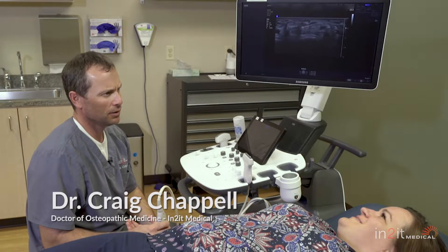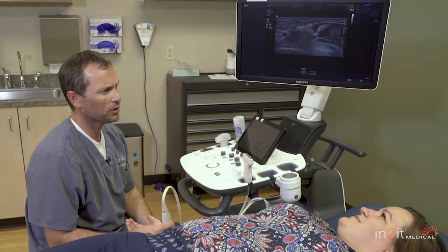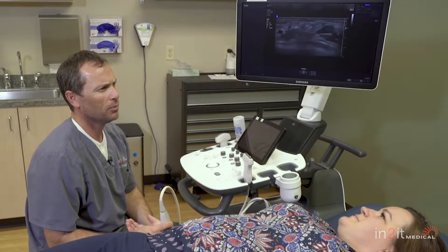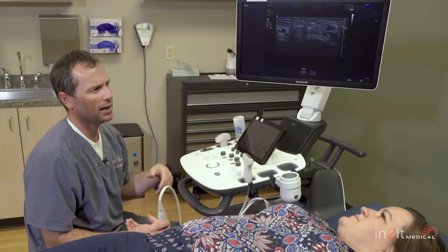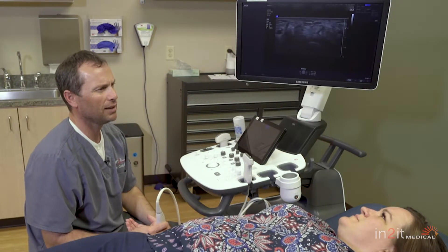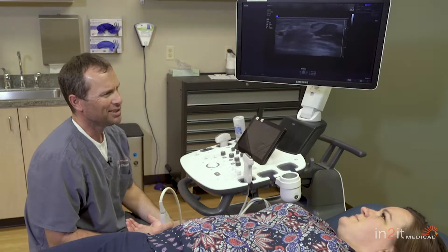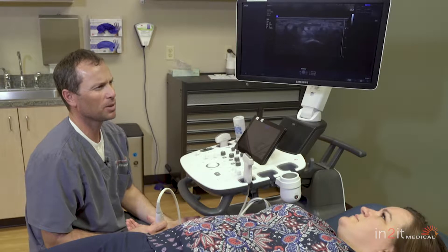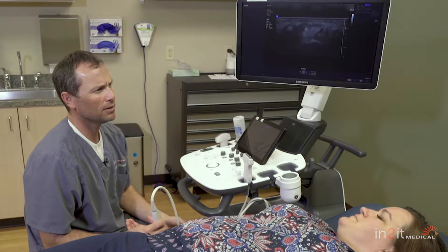Once again, back to nerves and ultrasound on how that's used. Carpal tunnel syndrome can also be diagnosed with the use of ultrasound. In the presence of carpal tunnel symptoms — which would be numbness in your hand, pain in your hand, that resolves with shaking, that wakes you up at night, that's worse with a fixed position or repetitive motion — that's generally carpal tunnel syndrome, but we can't prove it. We've got to make sure that nothing's wrong with the nerve or something else is not going on prior to participating in a surgery.